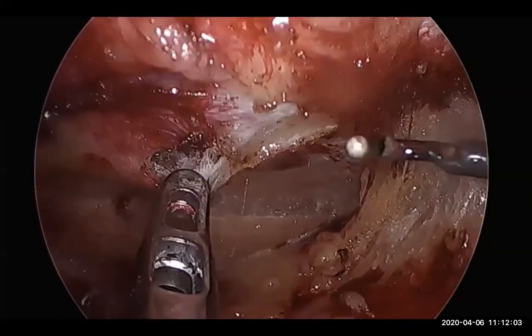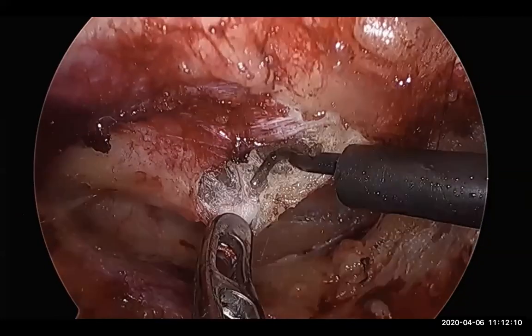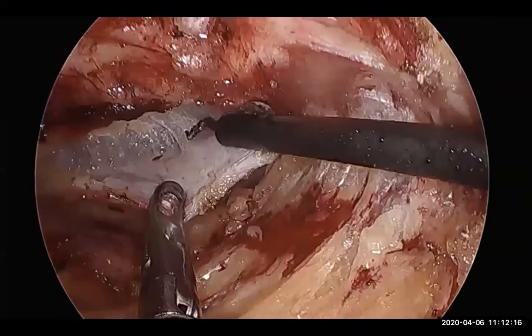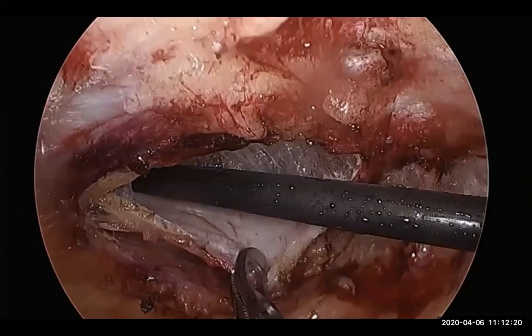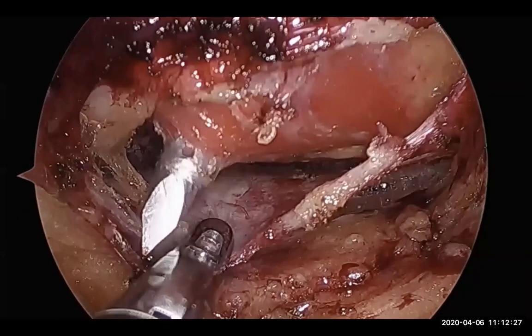So you can see that we are incising it right where the rectus muscle is present. Now your incision will have to be longitudinal, in the direction of the linea alba, parallel to the linea alba. So the grasper is holding the posterior rectus sheath of the right side, and the hook is creating some more space, allowing the 4th assistant port.